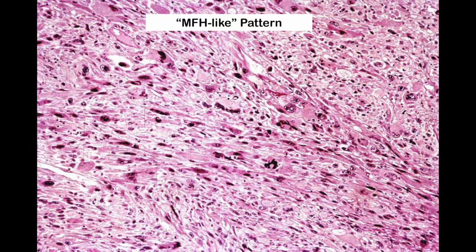And a number of ancillary diagnostic tests were performed on this particular tumor. All I can tell you is that there was a little bit of staining for smooth muscle actin. All of the other markers that were performed were negative, including epithelial and melanocytic markers, as well as a number of other sort of, quote, mesenchymal markers. Again, just focal smooth muscle actin immunoreactivity.